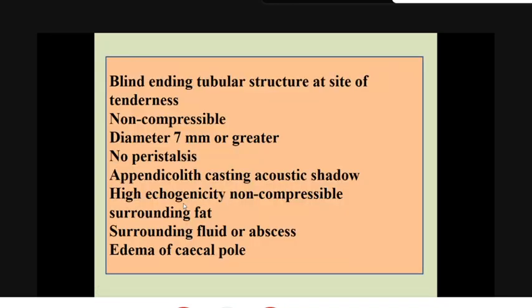So how can we diagnose acute appendicitis? By ultrasound. The technique of the ultrasound used to diagnose acute appendicitis is called the graded compression technique. The graded compression technique of ultrasound examination of the appendix. We use a linear probe with a frequency of at least 7 megahertz. يعني ما استخدم الكونفكس بروب اللي احنا نستخدمه for diagnosis of the abdominal organ.